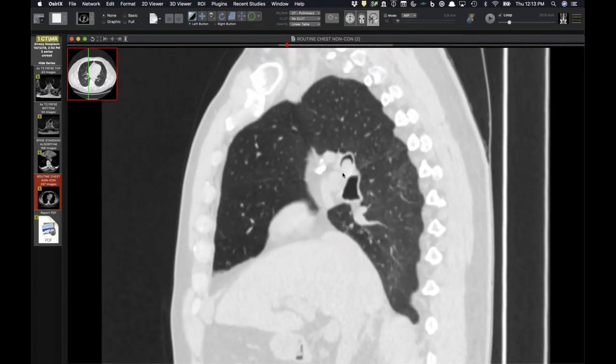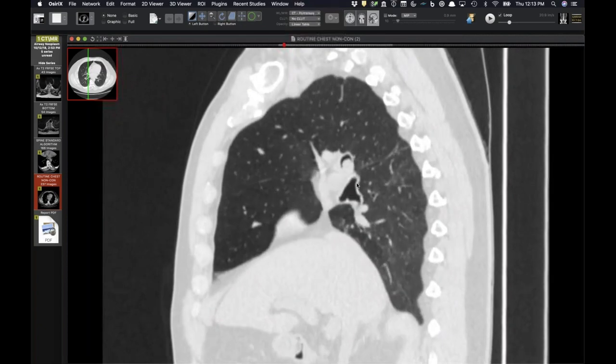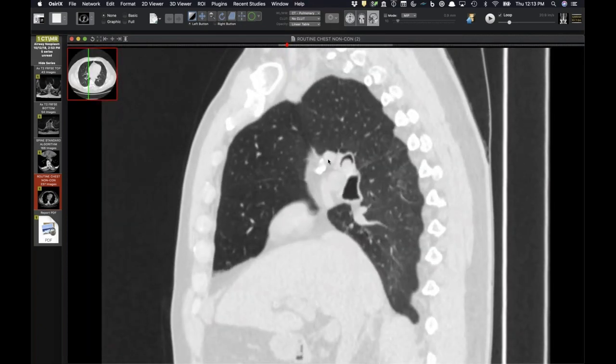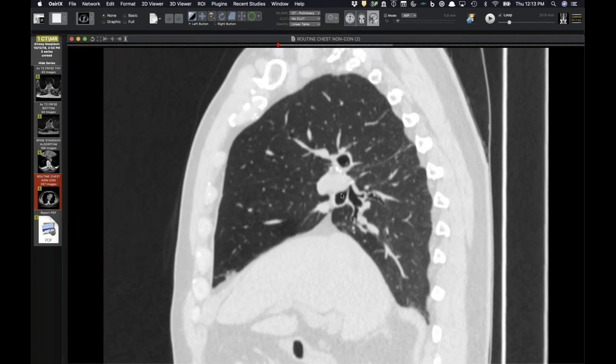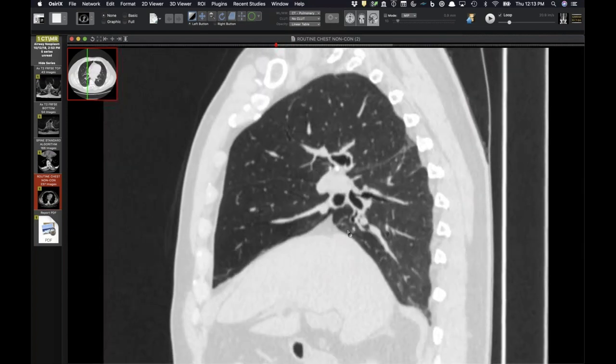And you can see here, it's just a good look for that and a good location in the main stem bronchus. It's a fun one since it was totally incidental, an accidental discovery on the spine CT. So, an atypical presentation of a typical carcinoid. Yes, exactly.